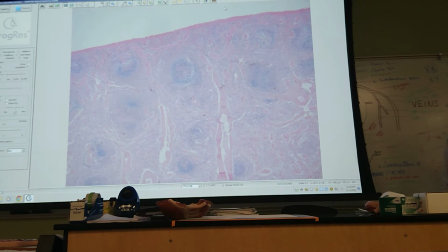You said the central artery has a continuous what? A lumen. A hole in the middle. It's a little tube. Okay?